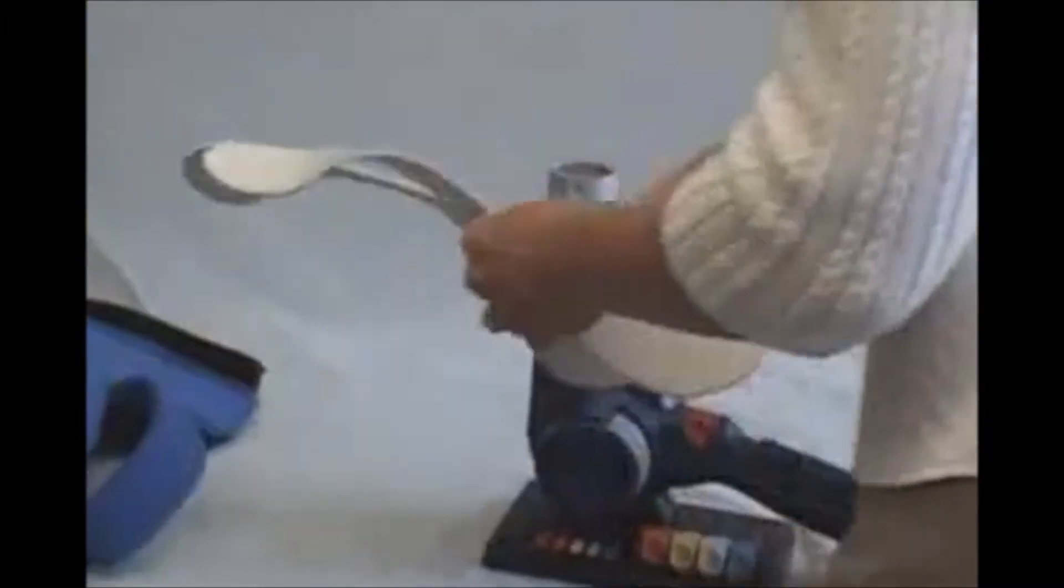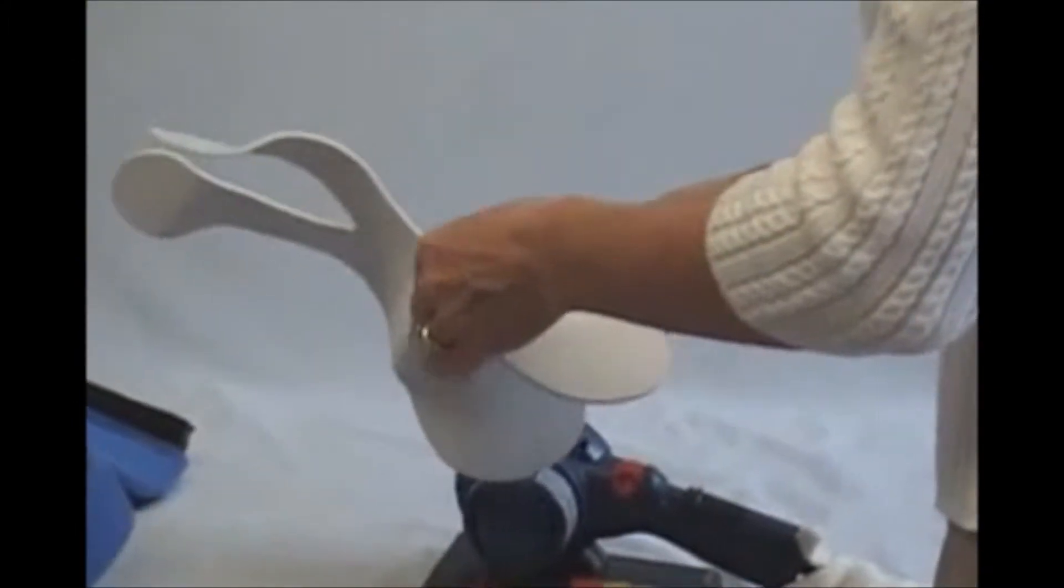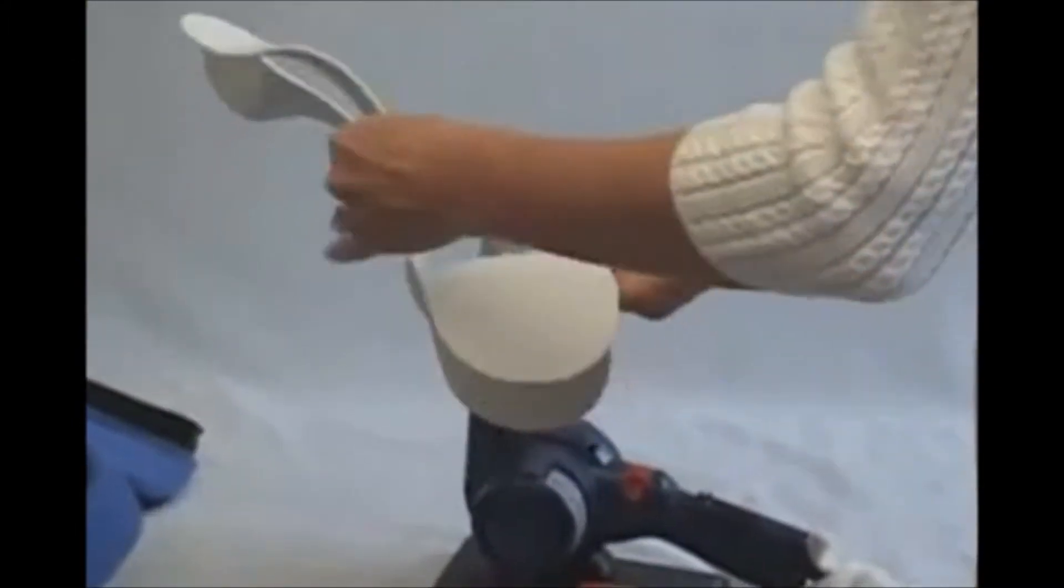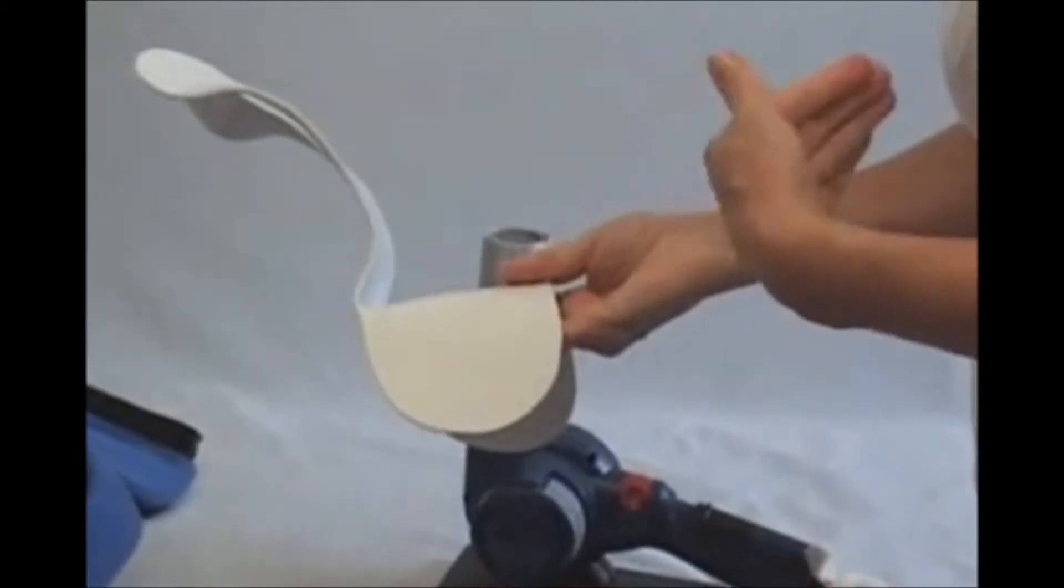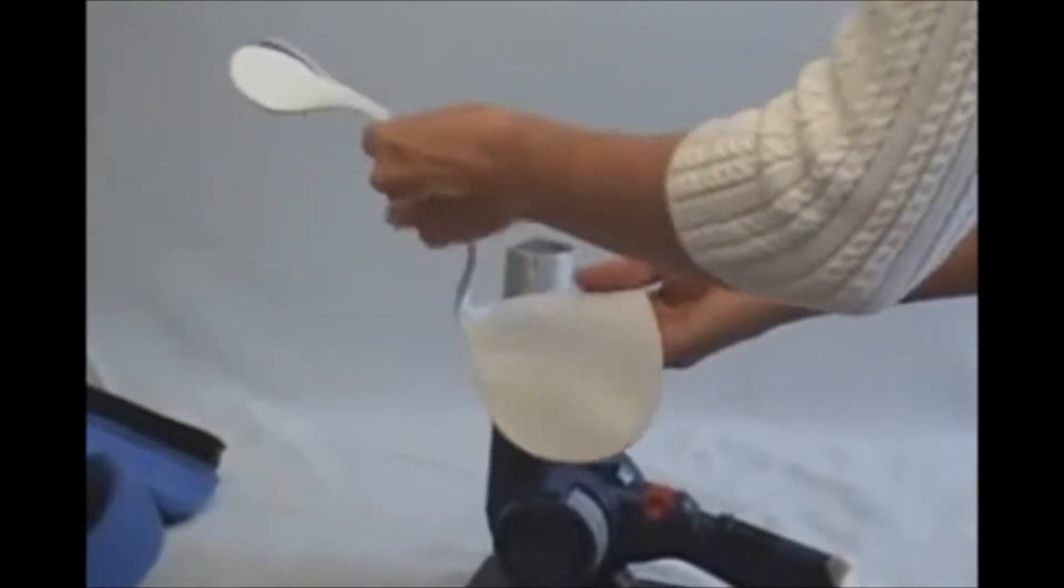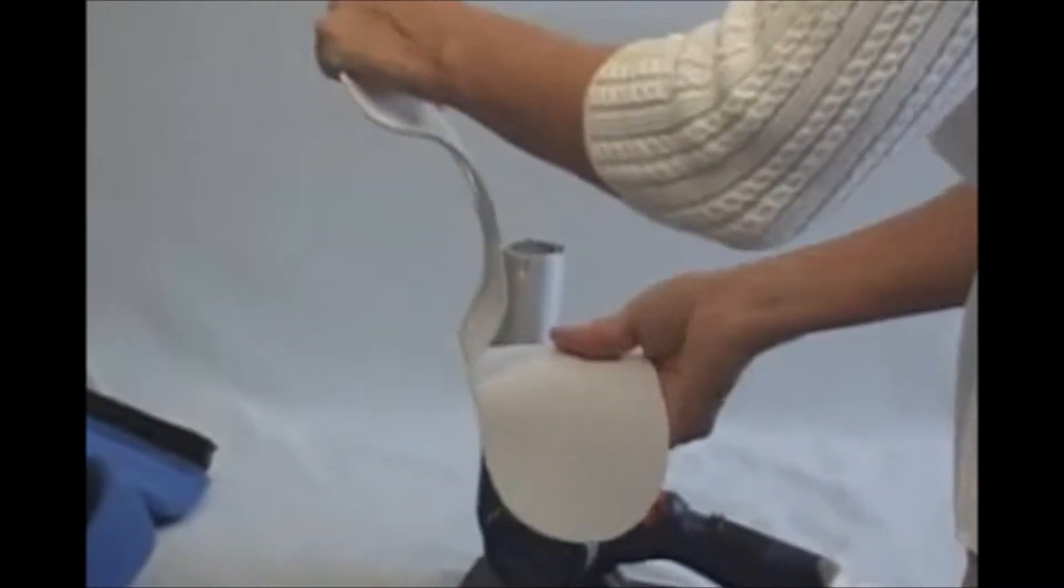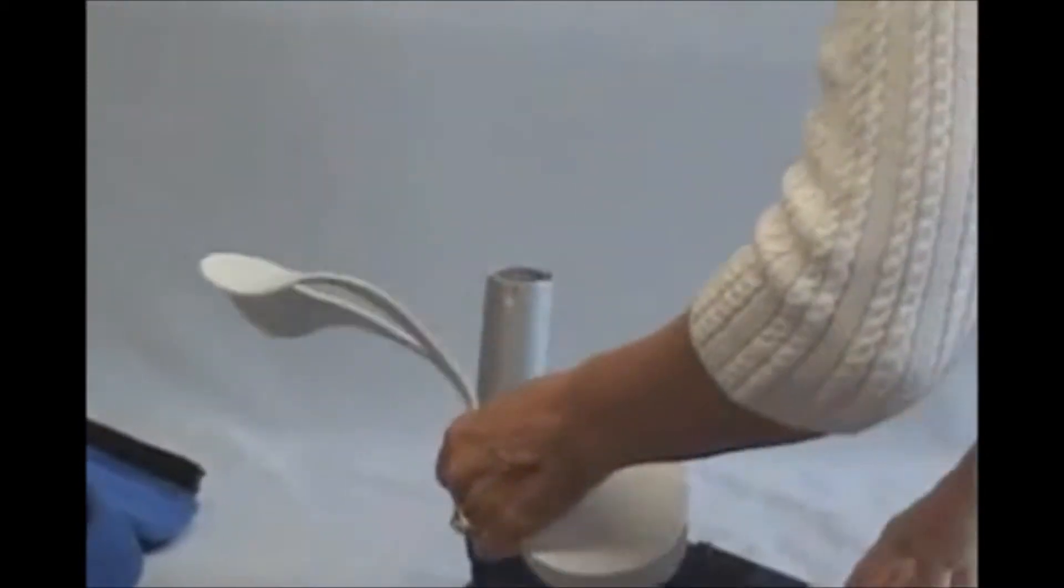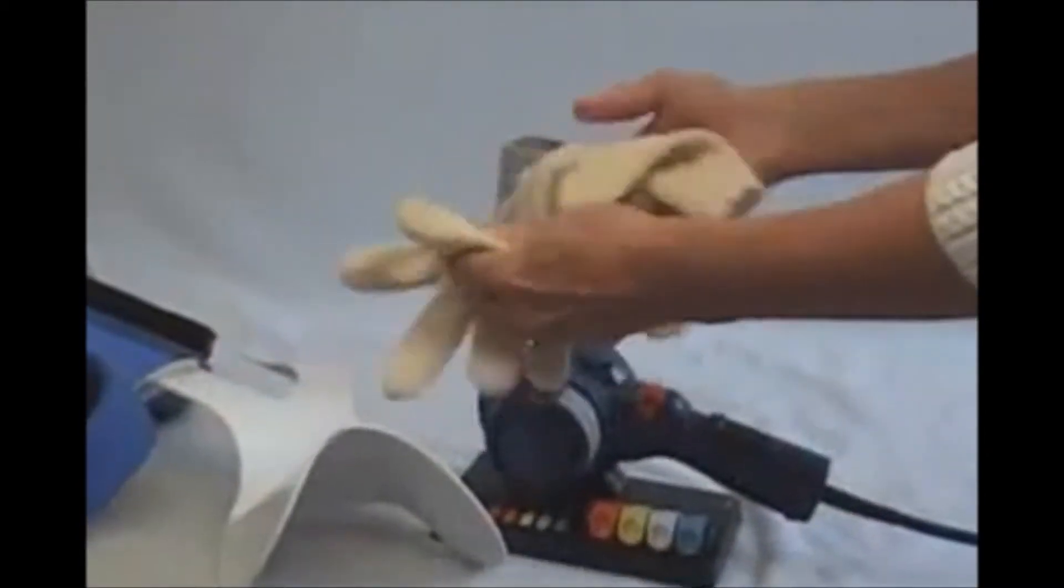We're going to heat mold it to change the degree of the neck. You only want to put slight pressure on the neck. It comes to you to hold the patient's head at normal. If there's lost range, you don't want to overstretch, so you're going to mold it for the individual patient.